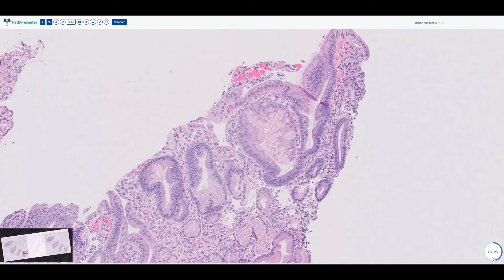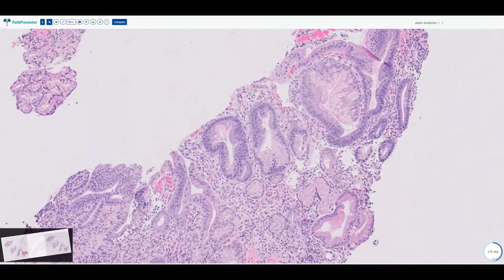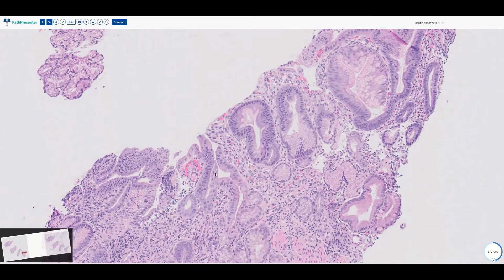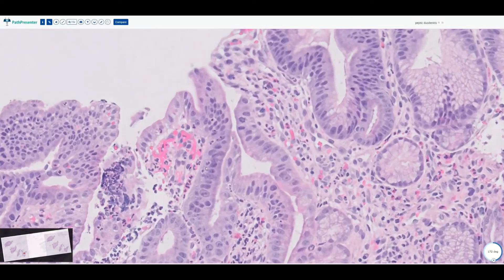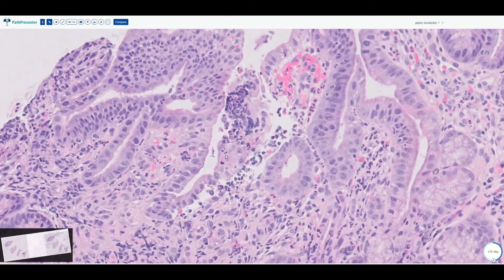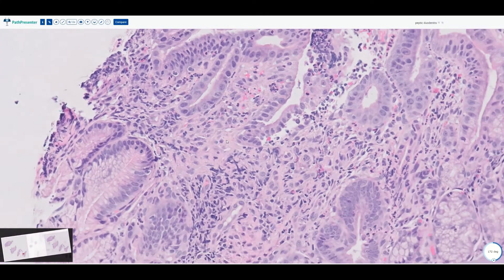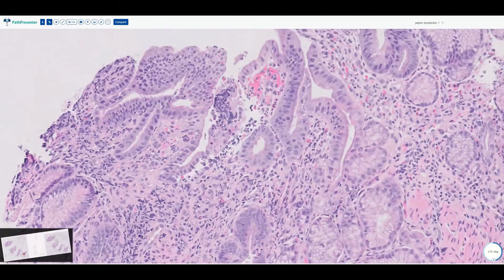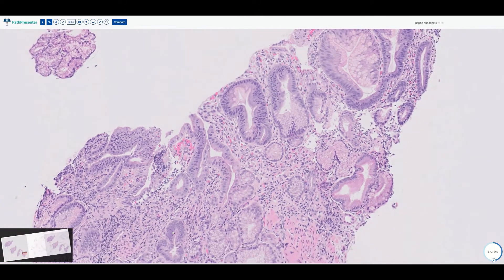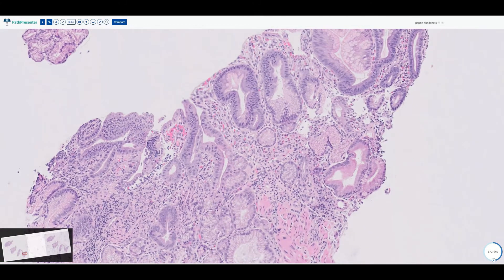This is considered foveolar metaplasia — basically saying there has been some sort of injury occurring to this mucosa, and that injury resulted in the normal intestinal-type mucosa changing to foveolar-type epithelium, which is better able to withstand the ongoing injury. Looking further, here's more foveolar metaplasia, and here you can start to see neutrophils infiltrating into the surface epithelium. Overall, the diagnosis would be active duodenitis with foveolar metaplasia.